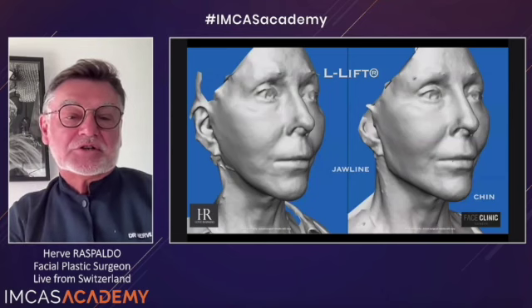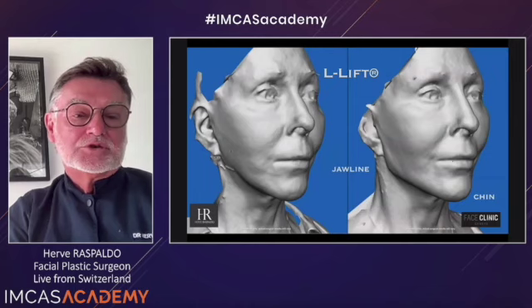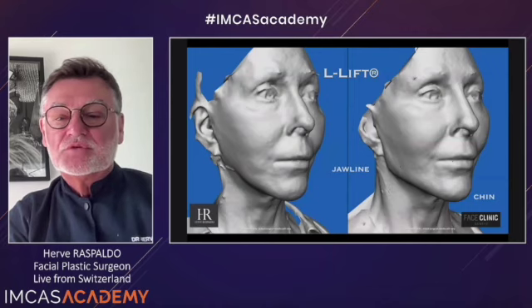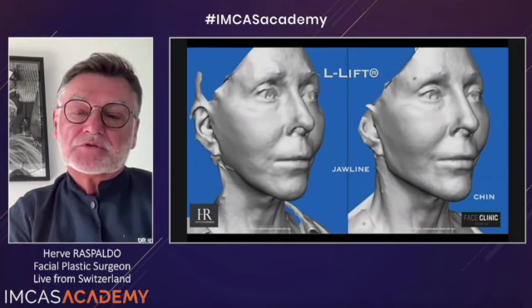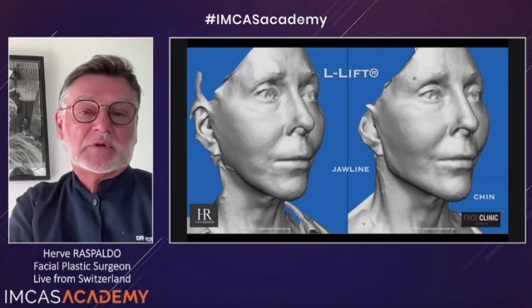And this is the patient on 3D. You see the 3/4 view, sorry. No chin, no angle, and a weird jawline. And then with 2 cc of double XL, you see that pyramid, that kind of triangle I recreated from the gonion, the horizontal branch, and the vertical branch of the mandible. And she also had 1 cc on the chin of double XL.